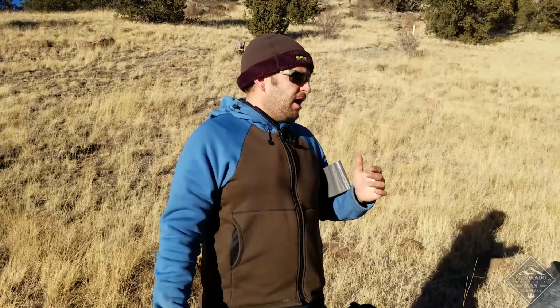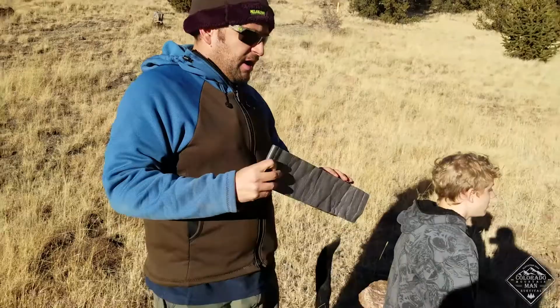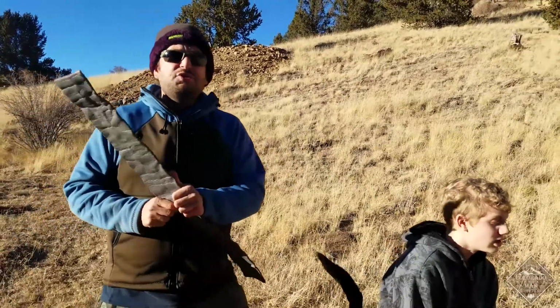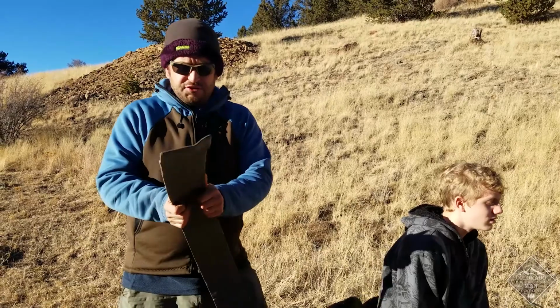So, one person rescuer, I have nobody else here. This guy just fell off some rocks, landed on the back of his shoulders. Maybe he's partially responsive, or maybe, so just for this demonstration, he's seated here. He's been walking around for a little bit. He's got some pain. I'm not even going to talk about clearing the C-spine. We'll do a video about that. But this is just on how to use the SAM Splint for a C-collar.